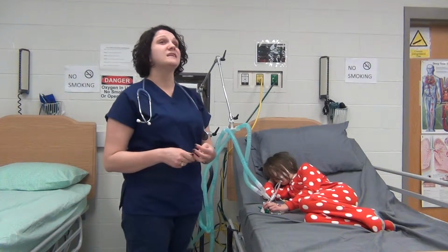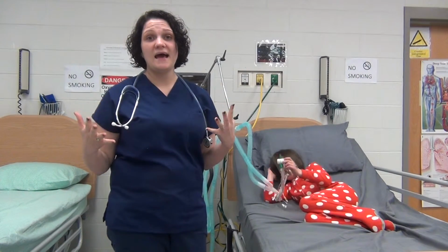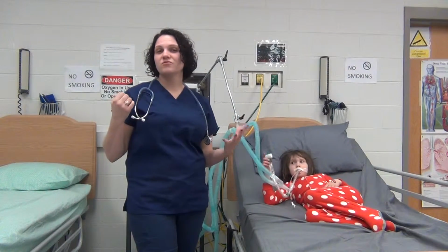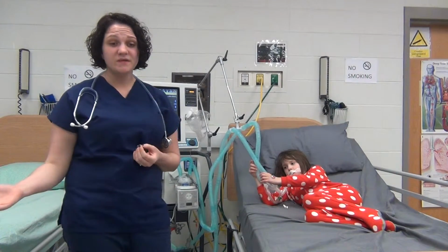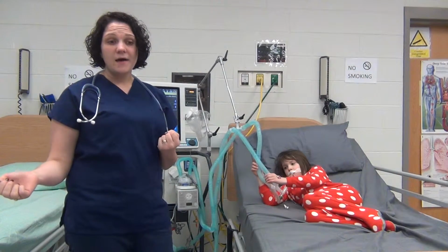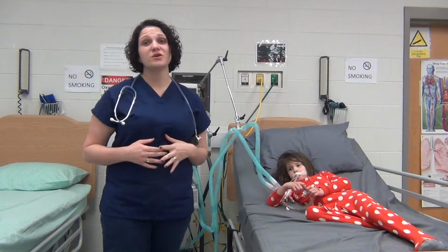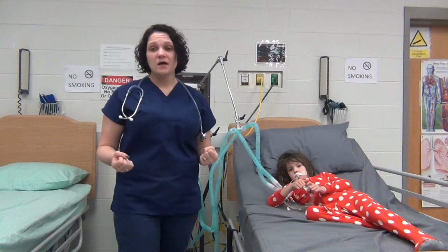I want to make sure she's taking nice, slow, deep breaths. I want to make sure she's getting an adequate tidal volume of at least 300 milliliters. I'll take 250 milliliters for a spontaneous tidal volume because once again she has been on the vent for a while, so her respiratory muscles are a little bit weaker.